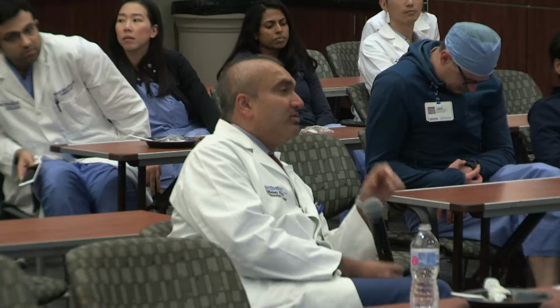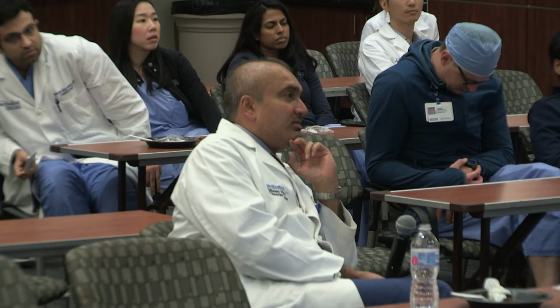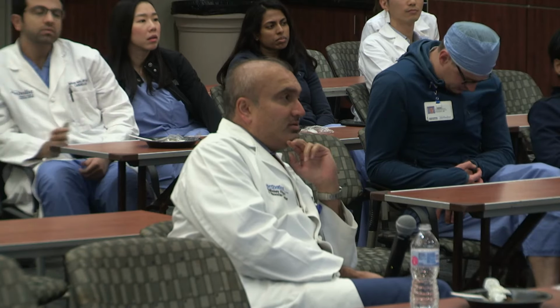If you can get the heart rate to 50, I think, unless a patient has a lot of, it's very big. I believe you have 50 heart rate, correct me if I'm wrong, my CT readers, I think I would say most of the time calcium is the least of the problem. But why would a slow heart rate help reduce the artifact? Calcium per se has this blooming artifact problem, but it's magnified exponentially by motion.